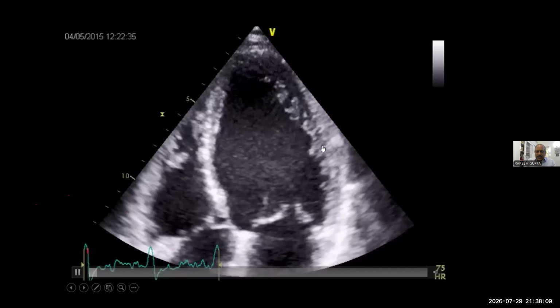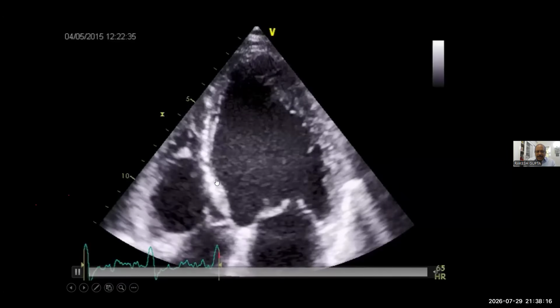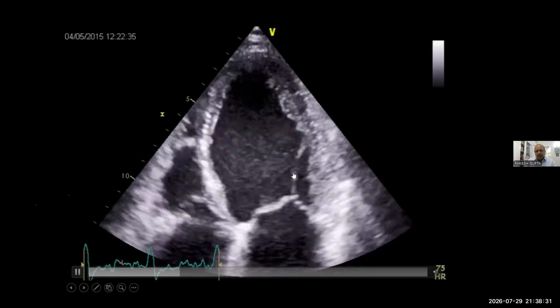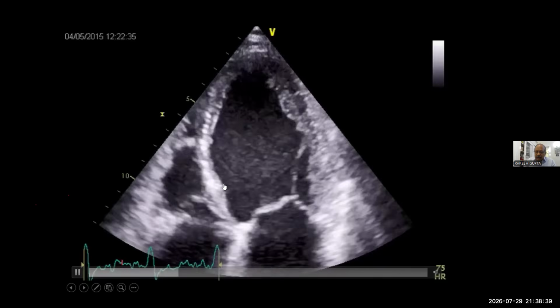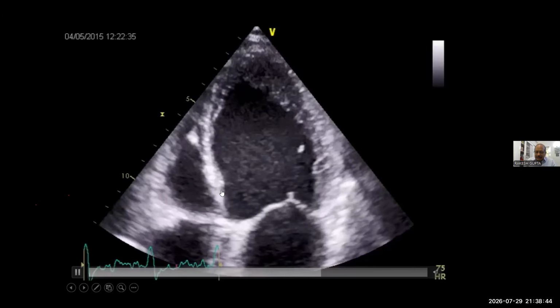If compared with this segment, it's not thickening at all. Then another important part is look at this basal and mid septum. It's almost akinetic. This is again hypokinetic. This is normally contracting and this is hypokinetic. Now see it again. That's what you need to appreciate. This is for sure, there is no endocardium seen over here. There is no thickening. So mid and basal septum is akinetic.